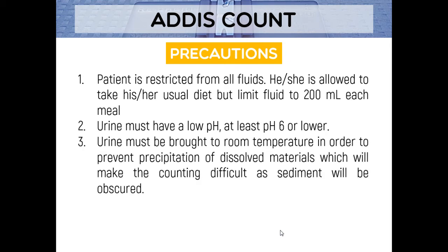Okay? All right. And room temperature japon, samot na na ref because again, di ba, mo precipitate ato mga amorphous materials, mga urates. So, which would make the examination or quantitation difficult for us. So we don't want that to happen. So dapat room temperature good siya, samot na if na ref ang imuhang specimen.